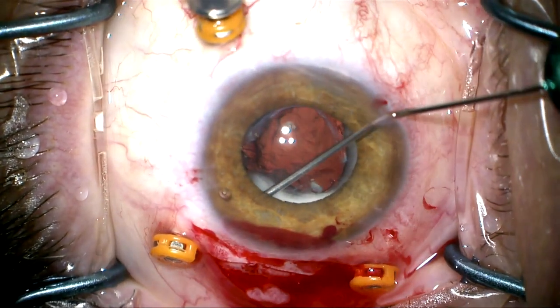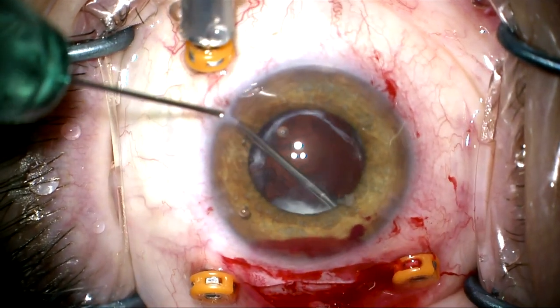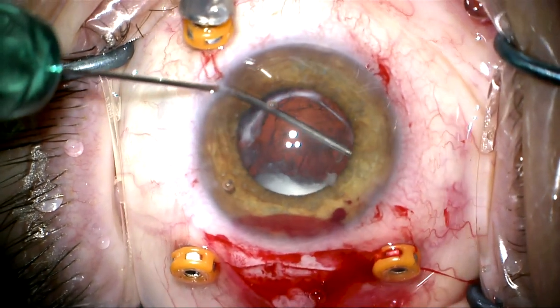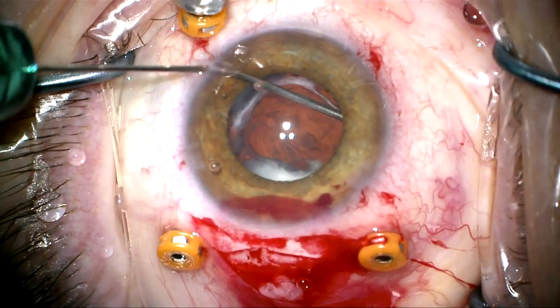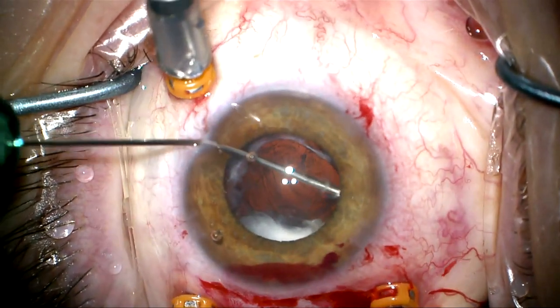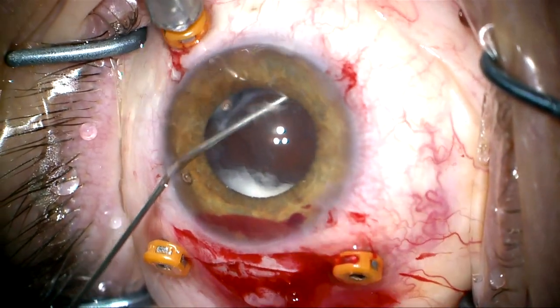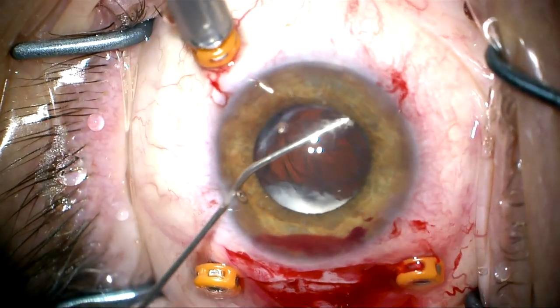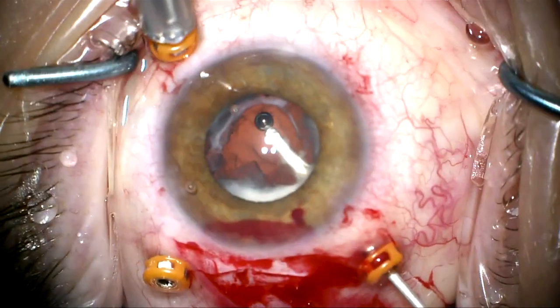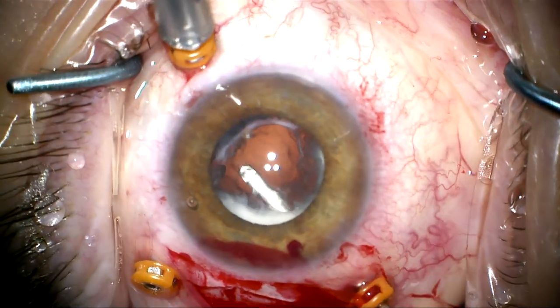I want to try to reopen this ring so I can get the Soemmering's ring out and put the lens in. We're dissecting with the cohesive viscoelastic using a pressure wave within the donut-shaped anterior and posterior capsule, going 360 degrees. This is going to kick up a lot of debris, so we're going to remove it with the vitrector to get a better view.